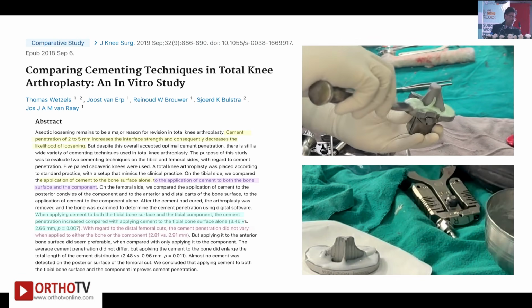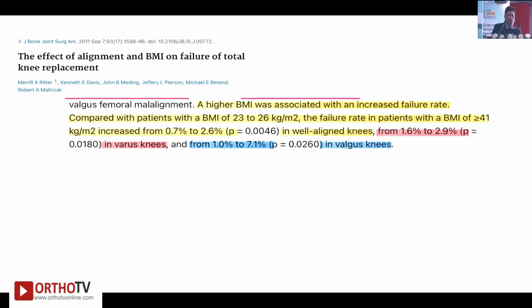the surface. The negative thing is that if you are applying it on the surface, you create a layer between it. When you are touching your gloves and everything over there, you can change the gloves, but still there can be a fatty layer that can cause issues with bonding of the cement on both the sides.